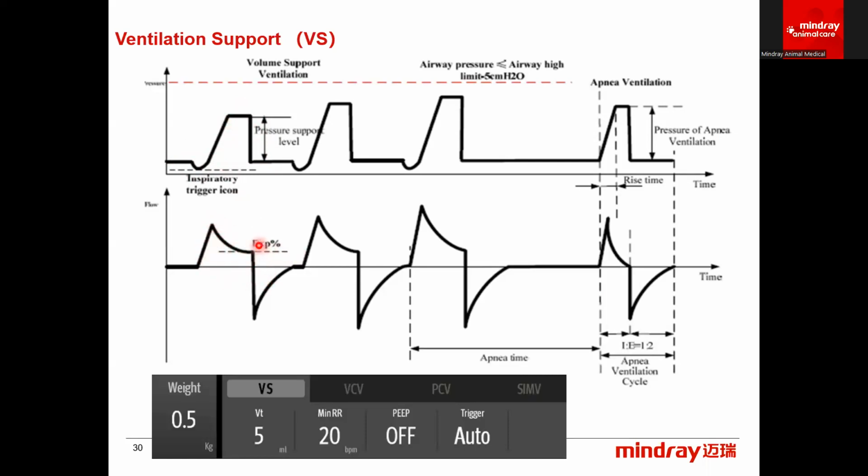Again, we have our automatic expiratory phase once your patient is no longer breathing in. And with each subsequent breath, we're seeing a little bit more supplemental airway pressure, trying to reach this tidal volume that we've set for ourselves.